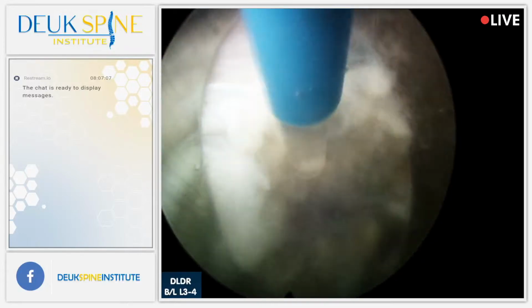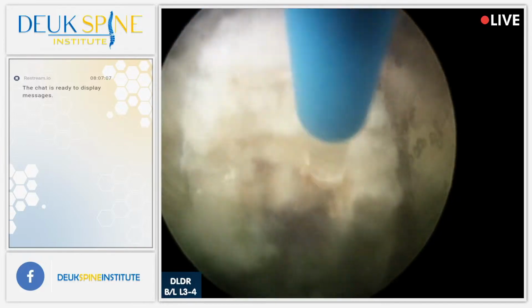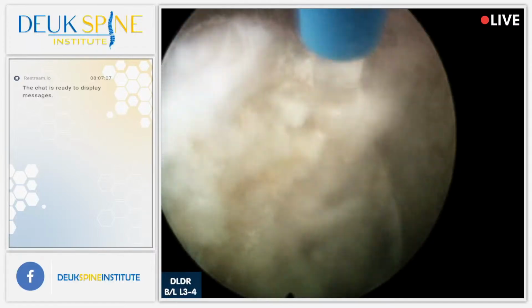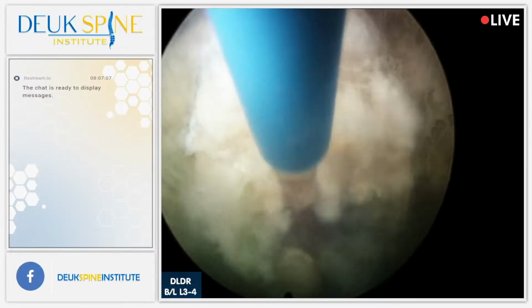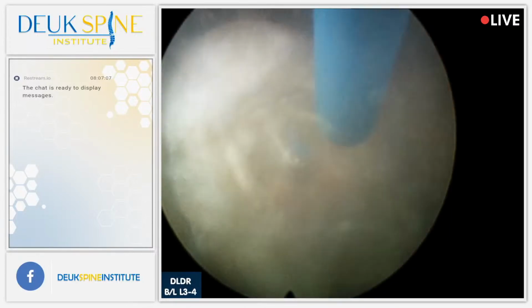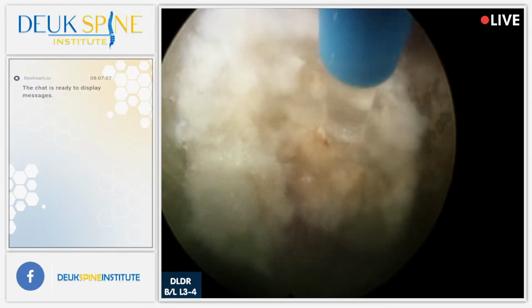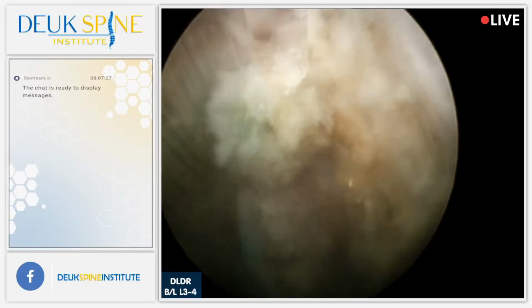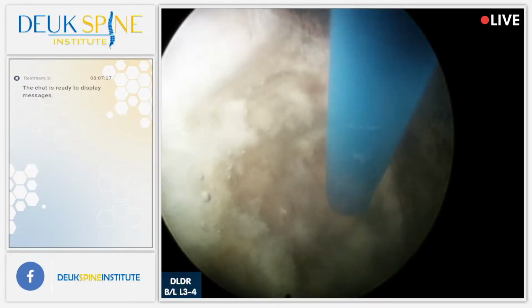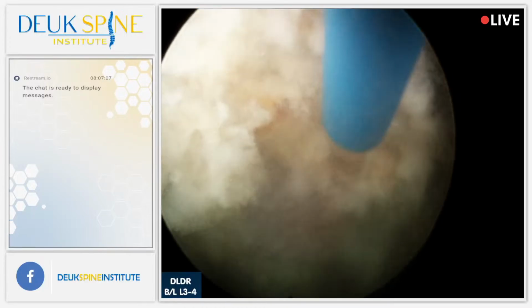All right, just about done here, folks. And then we'll take any other questions you have right now. I know the next surgery today is a plasma rhizotomy. Again, we're not broadcasting it, so this will be our only surgery today. We're broadcasting live for you to watch and learn. Now this patient's going to go home in about 45 minutes, okay? This is an outpatient surgery. Nobody stays in the hospital. There's no hospitalization. There's no painkillers. There's just Tylenol, usually for a night. And that's it.